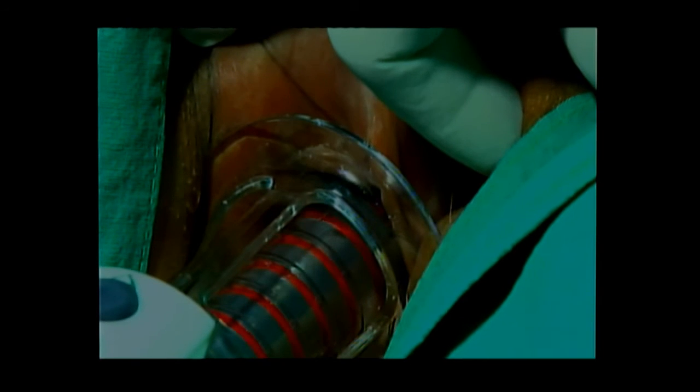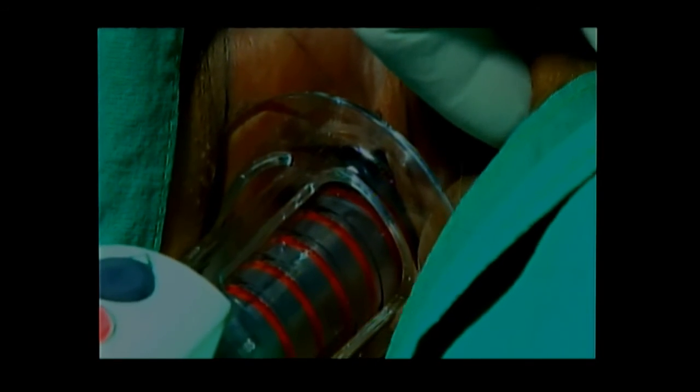And now it's reaching the posterior fornix. So first it came out from the posterior, then went in, then came out, then went in once. So 3 cycles in about 8 minutes. And this is the basic 3 session, but I recommend doing 5 because you get better results.